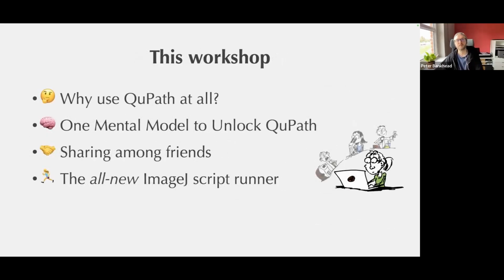So within this workshop, one of the things that I would like to do at the very start is, assuming that you might be coming to this from the ImageJ Fiji background, not entirely convinced you should use QuPath at all, I want to say a little bit about some of what QuPath could potentially do for you and why you might want to consider using it. Then I want to describe one mental model that can help you make sense of QuPath. Because whenever you open it, you might see there's lots of different commands and lots of different options in there. But if you have this one model in your mind, then it can hopefully make sense of the entire software and be the key to becoming an expert in it.